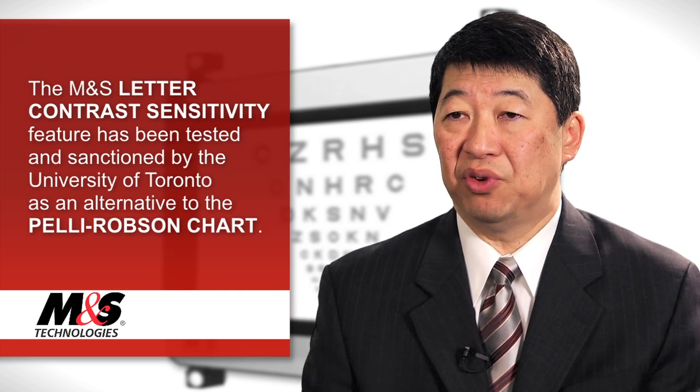Well, I think there are certainly going to be a lot of changes ahead of us. I think traditionally third-party insurers have really left it to the doctor and the patient for the most part to decide on the appropriateness and the timing of cataract surgery. I think in the future, however, there's going to be far more emphasis on documenting outcomes and improvement, and this is where I think it'll be harder to get away just with the Snellen chart alone, particularly under high contrast.